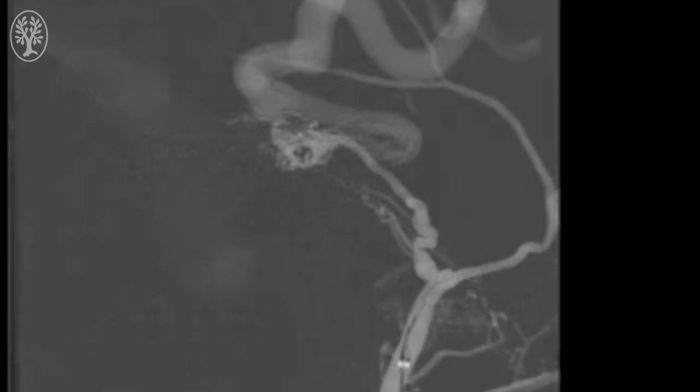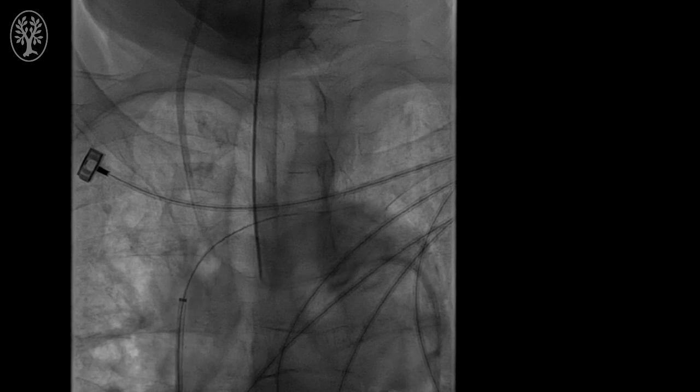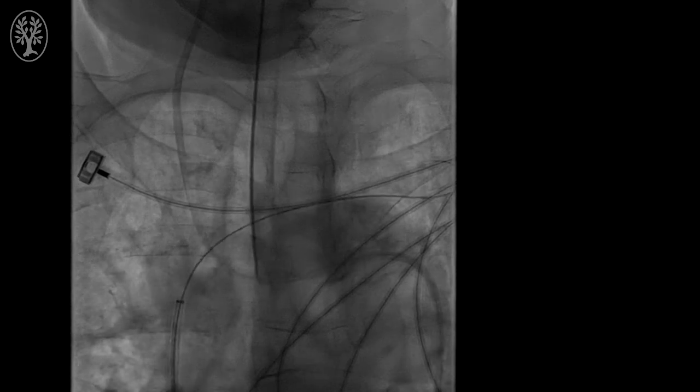and abnormally enlarged branch of the middle meningeal artery. We try several times to get access into that artery. You can observe the wire. Because of the tortuosity here, the wire and the microcatheter don't really want to take that turn. So we stopped there, and we then went ahead and obtained vein access.